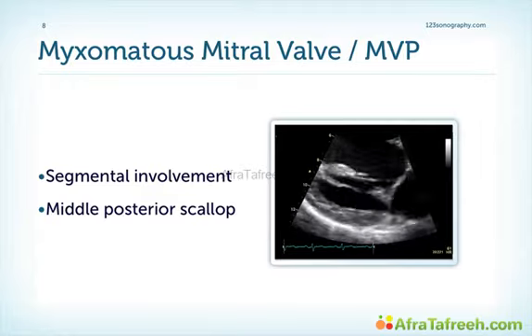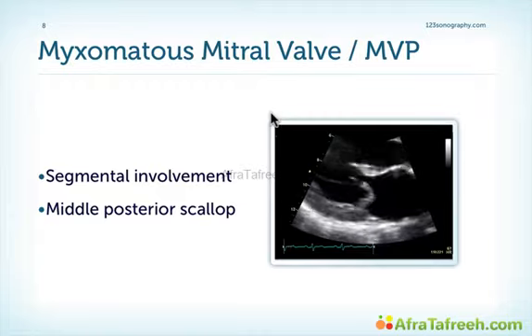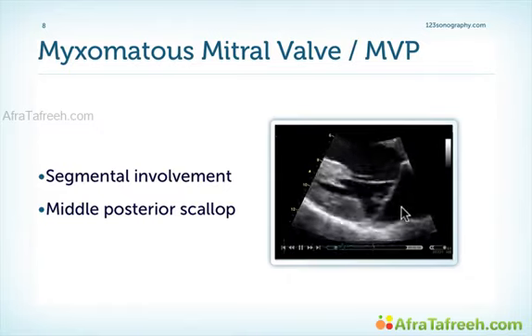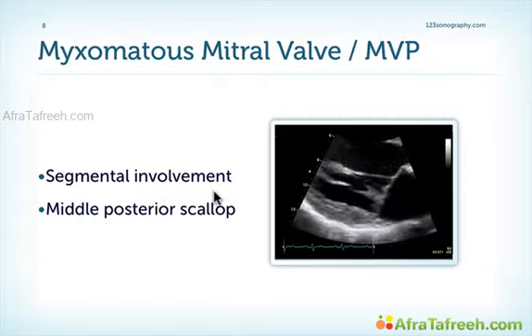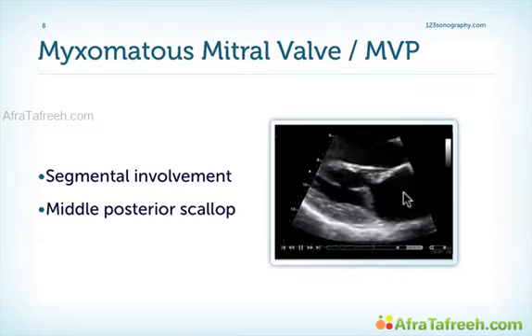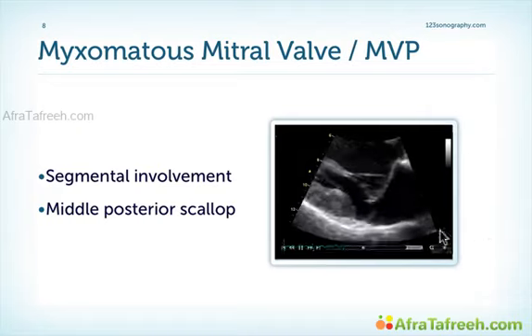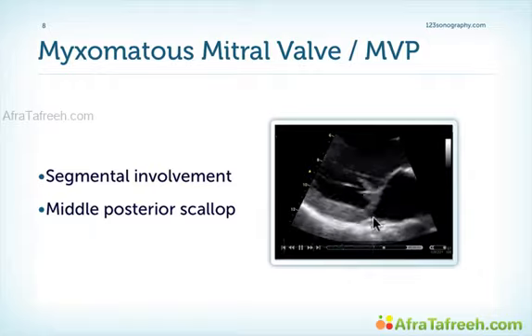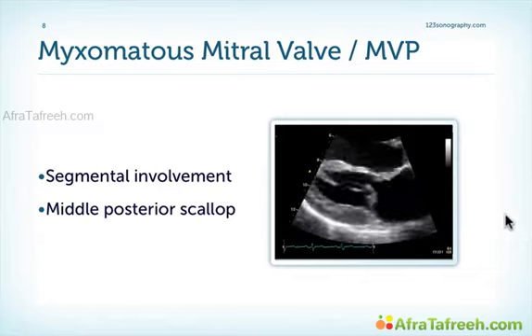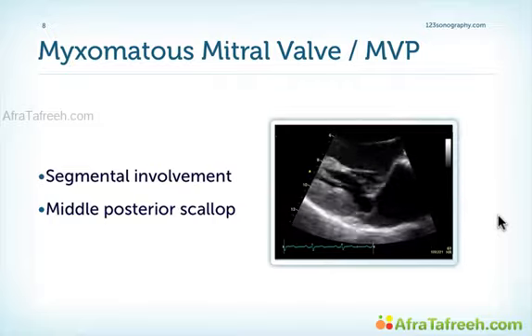How do we actually make the diagnosis of mitral valve prolapse? Well, certain measurement criteria have been proposed as to how much the valve has to prolapse into the left atrium to make the definition of a mitral valve prolapse. But those are very unreliable simply because there's always segmental involvement, and it depends very strongly where you use your cut plane or where you measure the prolapse. So in reality, it's more a visual assessment kind of a diagnosis, and a diagnosis where you not only incorporate the amount of prolapse or the presence of prolapse, but also the thickening of the valve and the rocking motion. Remember, it's a syndrome. There are more findings aside from the mitral valve prolapse. Also look for those to make the diagnosis.